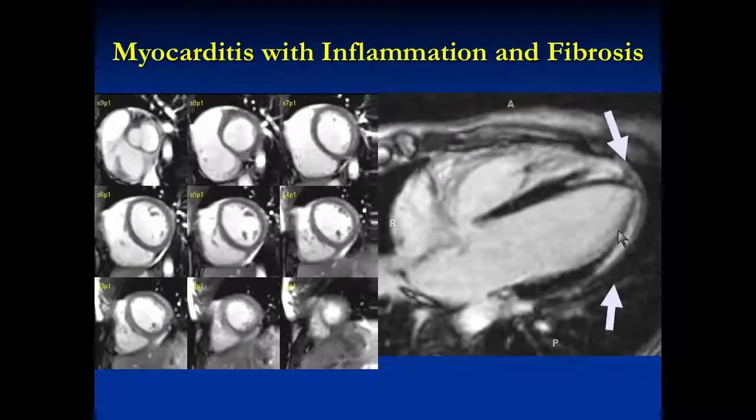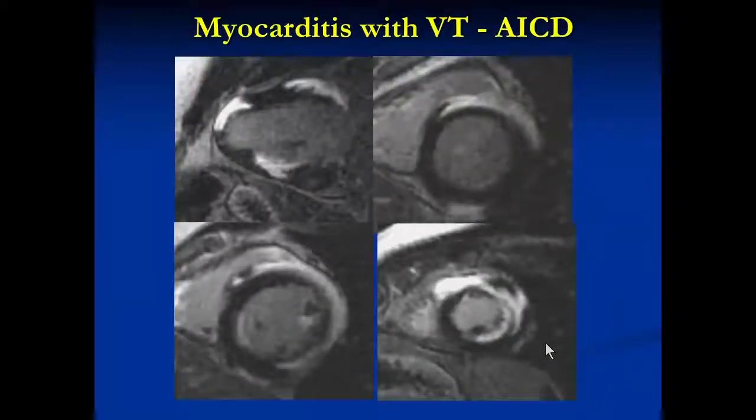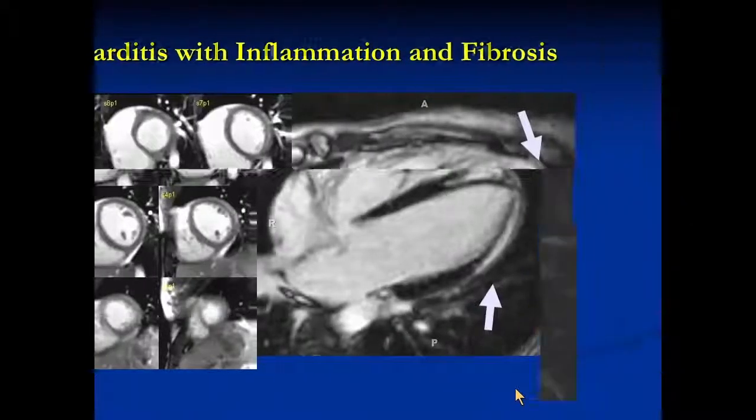And sometimes in the first presentation of this, they'll have delayed enhancement, like in this patient, a 25-year-old person who had delayed enhancement right in the beginning.